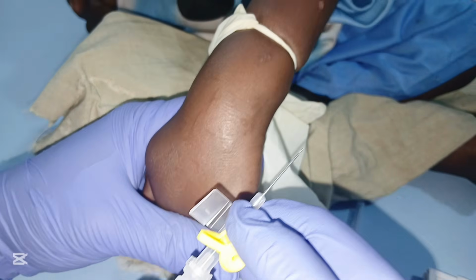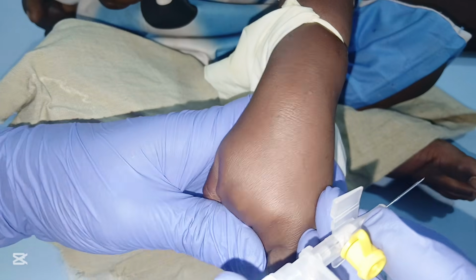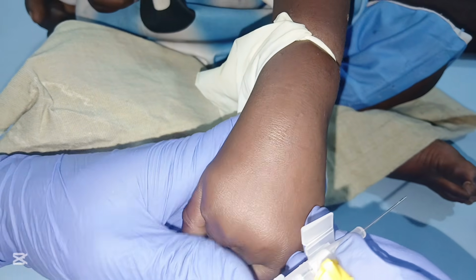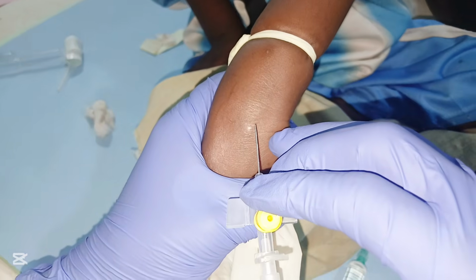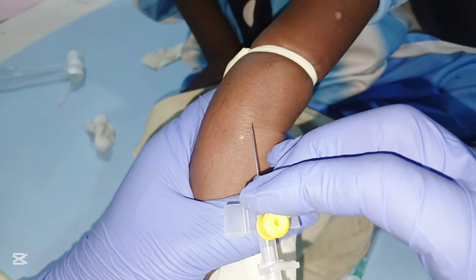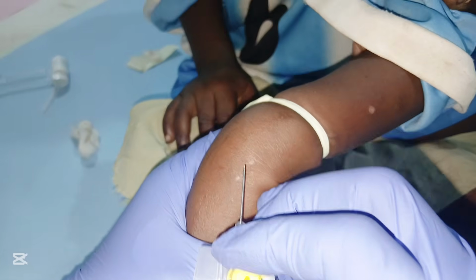So here we go. This is how you are going to perform. Make sure first you retract back the skin. So this is how you are going to perform pediatric IV insertion. Super.